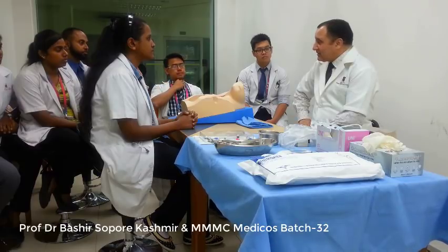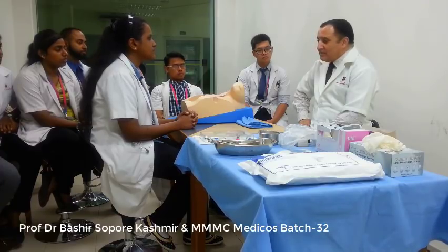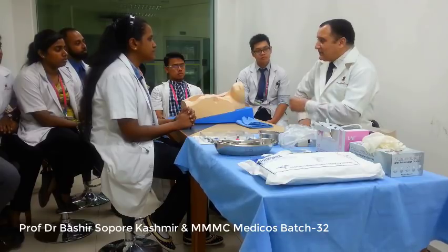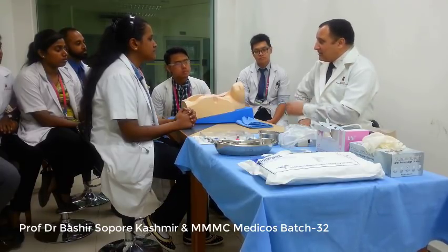The other relative contraindications are distorted local anatomy, vasculitis, when the patient is unable to cooperate, or if there is the presence of carotid artery disease.